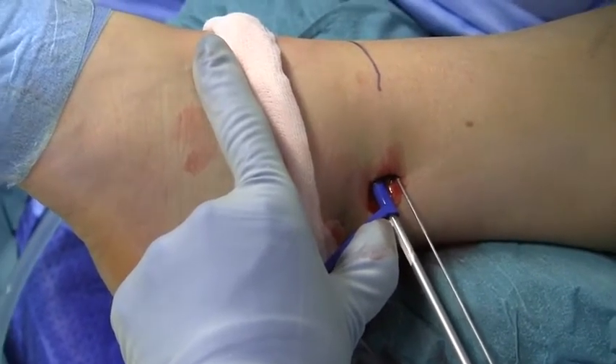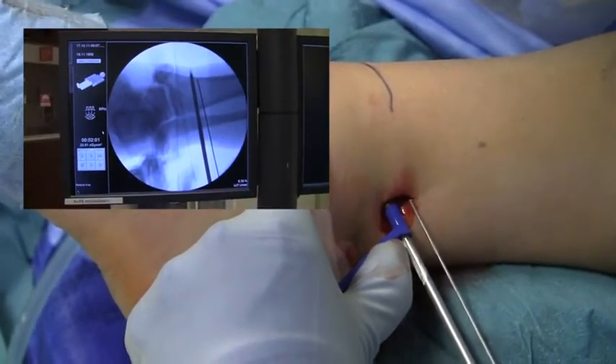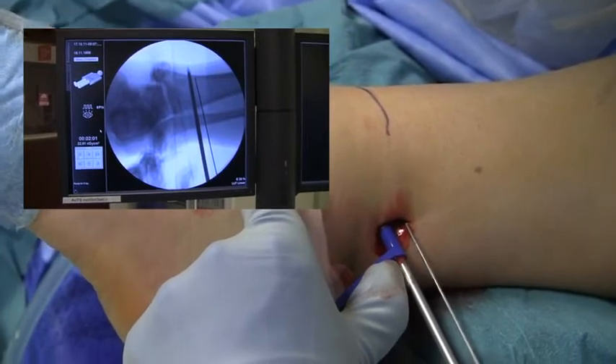The drill hole should be placed at the level of the inferior tibiofibular joint, angled 20-30 degrees from the lateral to the anteromedial part of the tibia.